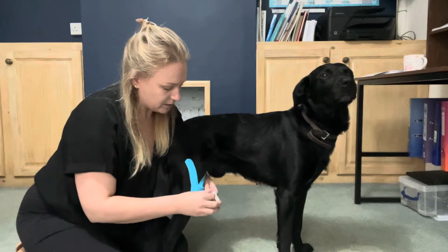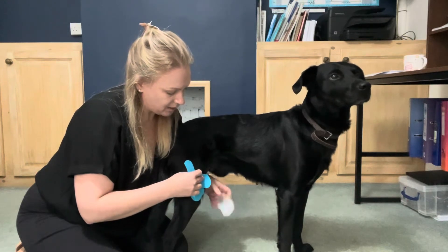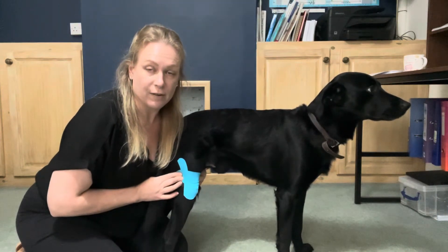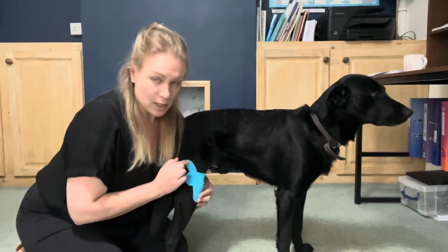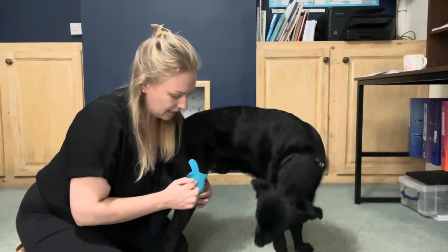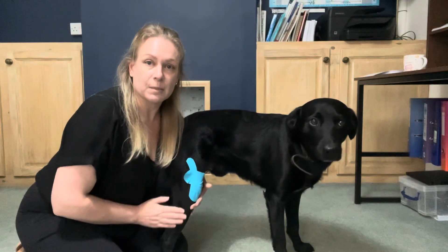Your eye strip is then going to come across the top — stick the middle section down first, and then applying 40 to 50% stretch, stretch it across the front. So you have your Y sitting underneath with the two arms coming one laterally and one medially across the patella, and the eye strip sitting right across the patella at 40 to 50% stretch.